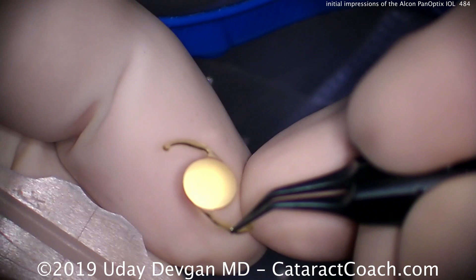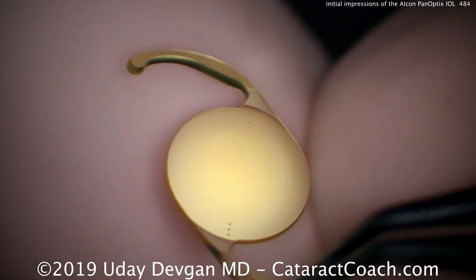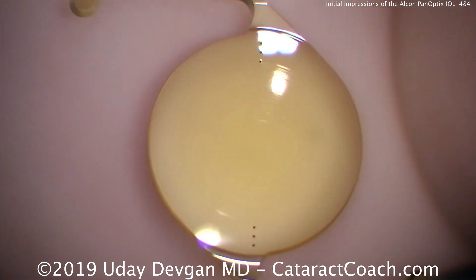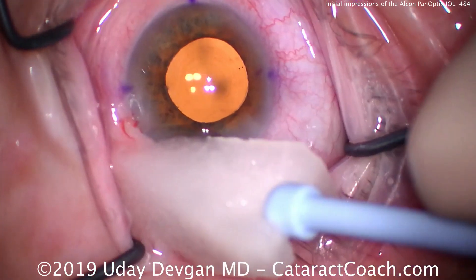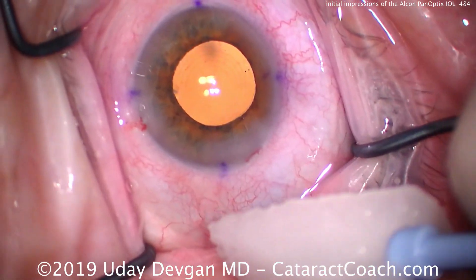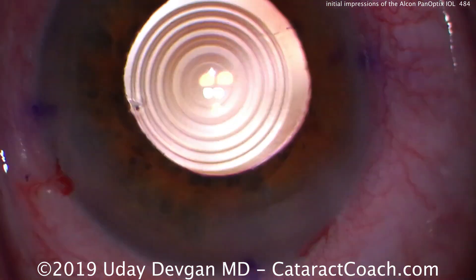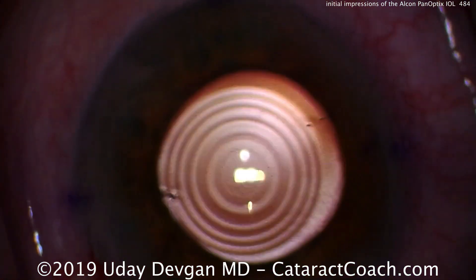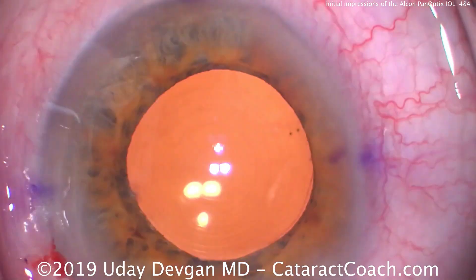We can zoom in and look at the diffractive rings in that central 4.5 millimeters of the optic — there they are. I think the design is certainly great in that it does deliver, as promised, a very wide range of vision. These patients in general have very good acuity from about 16 inches to far away, and it seems pretty seamless.